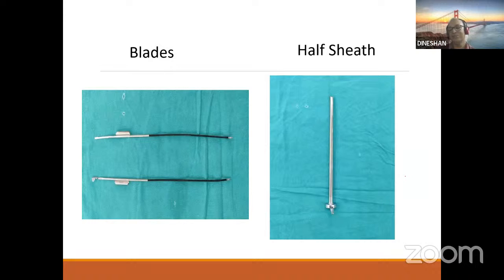Once in a while, in a difficult stricture, you may attempt it, but you may be asked in the exams. Those are the situations where you can land into problems like injuring the vessels, priapism, and requiring this self-dilatation also.